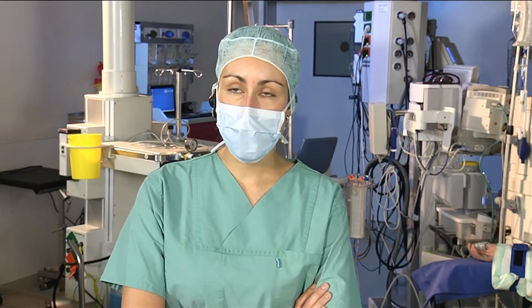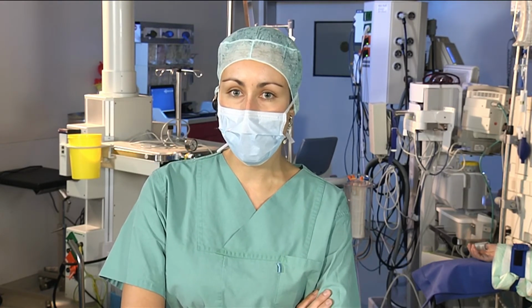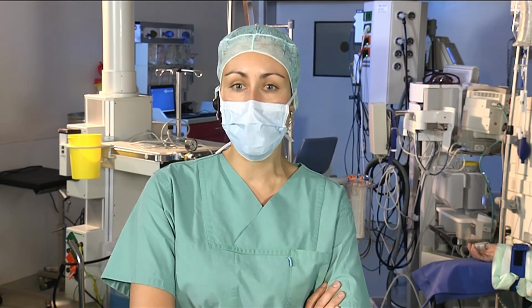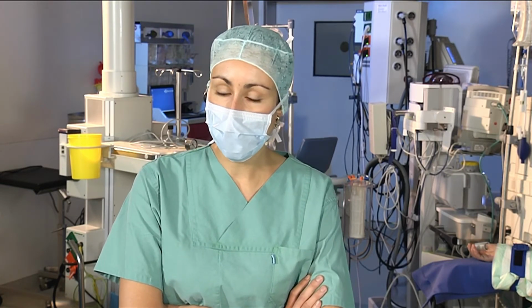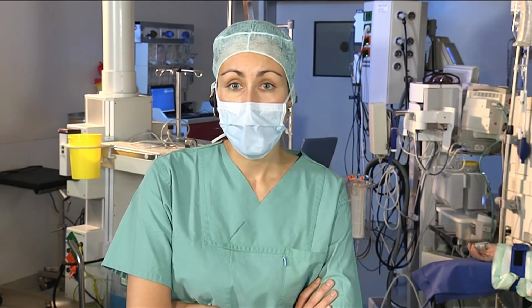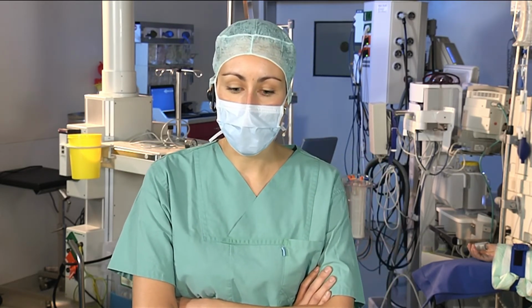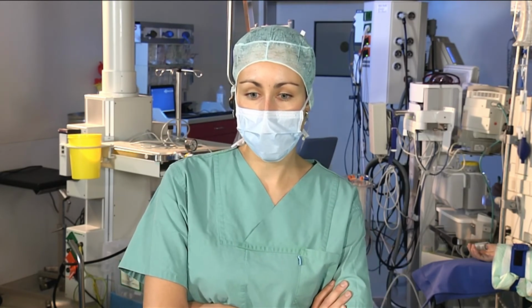Yes, the candy plug, different than the true lumen stent graft, should be oversized to the maximum diameter of the false lumen 1 centimeter above the celiac trunk. So there should be an oversizing of 10 to 30%. This should be ideal for the candy plug. So there should be an oversizing, not in the true lumen stent graft.